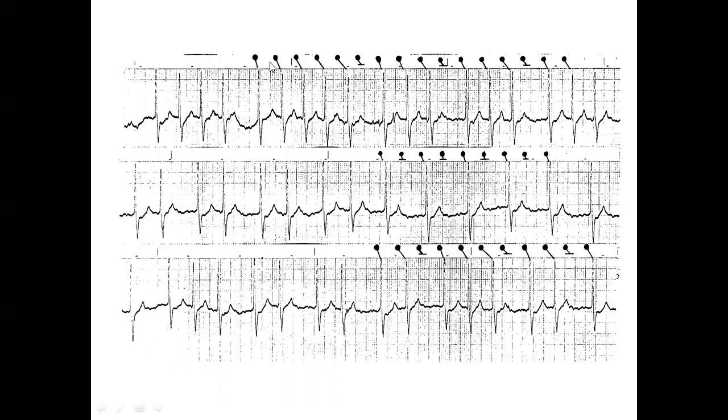It can be diagrammed like that. The junctional pacemaker is accelerated and firing at about 150 per minute. And promptly, delay, further delay, further delay, further delay, blocked. Promptly, delay, further delay, blocked. Here, it's a junctional tachycardia with 2-to-1 AV conduction. Junctional tachycardia with 3-to-2, 4-to-3, 3-to-2. So exit block, far advanced state of digitalis intoxication. If we did not recognize this and continued to give digitalis, the patient would die in digitoxicity.